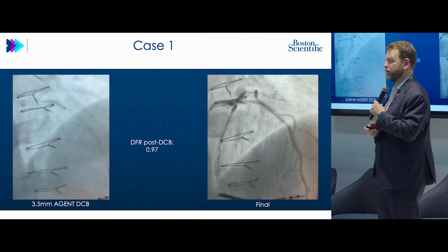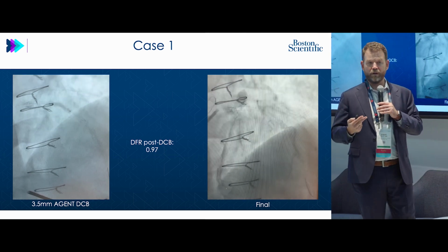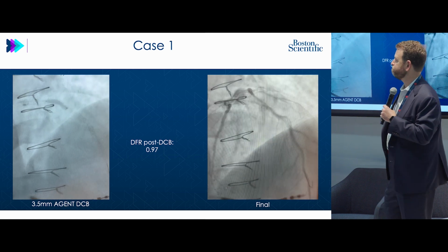This is the final angiographic result. So we have a very good physiologic result. We have an excellent IVUS result. We have an excellent angiographic result.